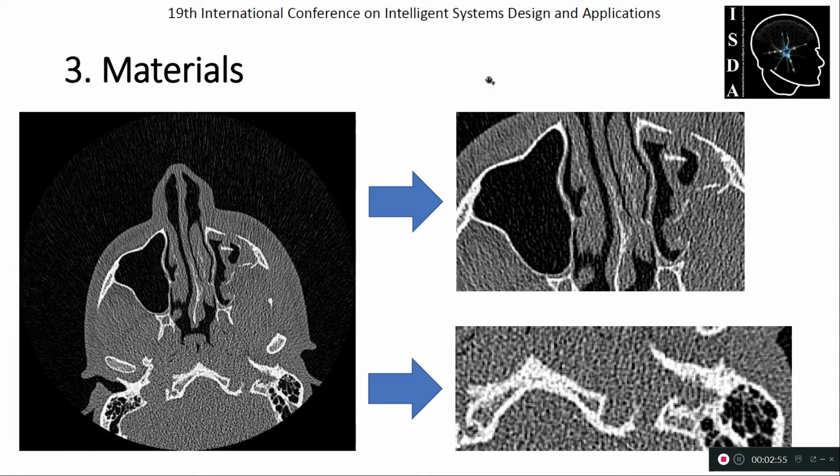As you can see, there is noise in all structures, in all the slice here. So in the gray structure, as we call the foreground region, you can see the noise, and in the background region, you can also see the noise in these areas here.